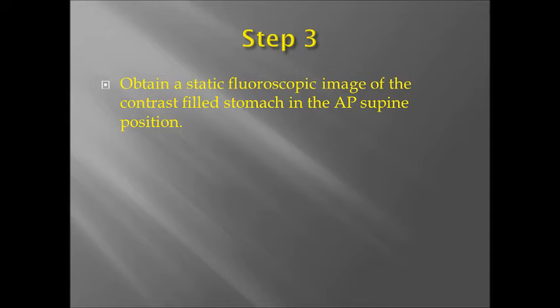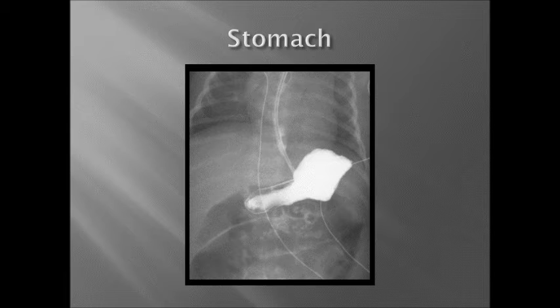Step 3: Obtain a static fluoroscopic image of the contrast-filled stomach in the AP supine position. Here is a static fluoroscopic image of this step.